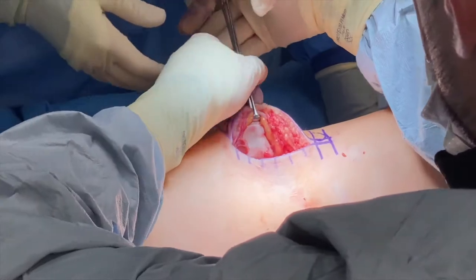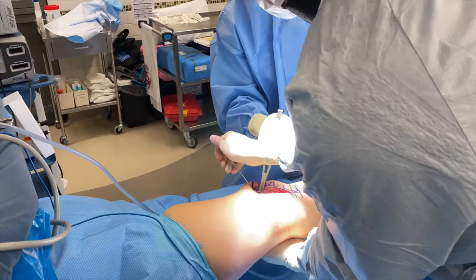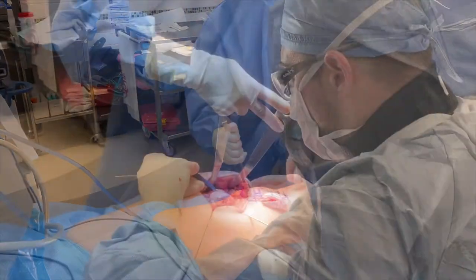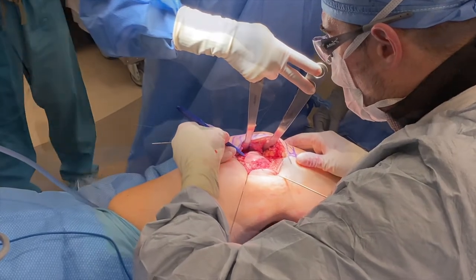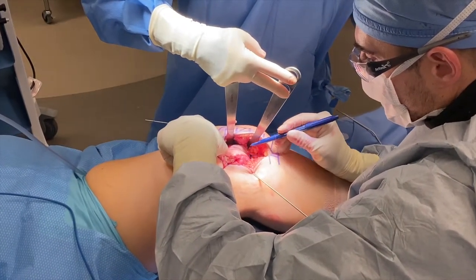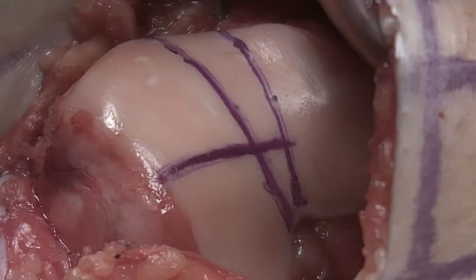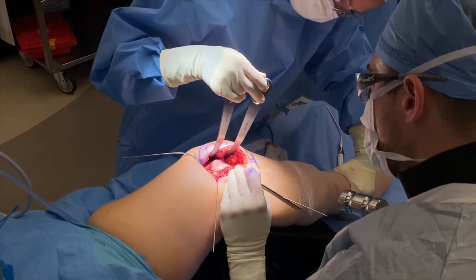I then cut through the deep retinaculum and the capsule, and place several pin retractors so we can adequately see. I then mark out the end of her femur, noting the location of her current groove and the location of the new groove. For the surgeons out there, by centralizing this groove we are essentially reducing the TTTG, obviating the need for a tibial tubercle osteotomy in many cases.